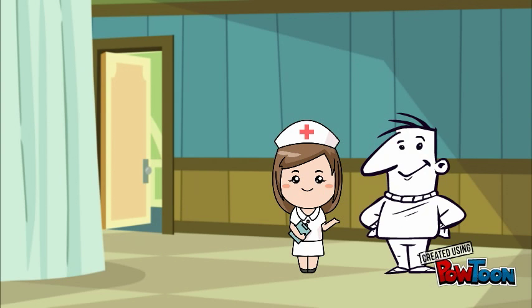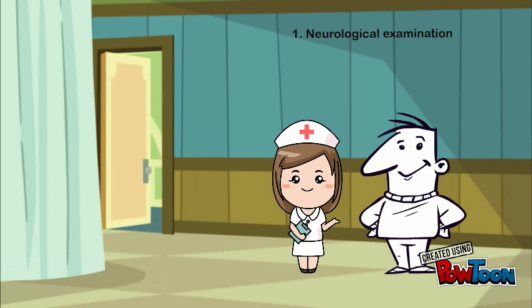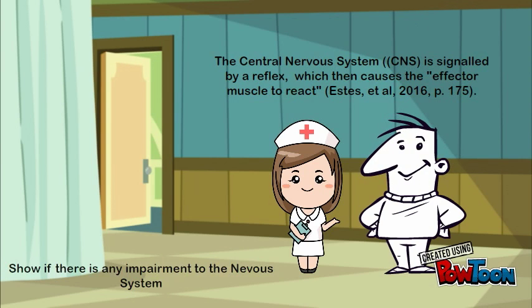Firstly, I'm going to perform the neurological examination, and that just means I'm going to see how your sensory neuron and motor responses are working. I'm just going to shine a light into your eyes and just look straight past my shoulder. Now if you could follow the light with your eyes. That's great.